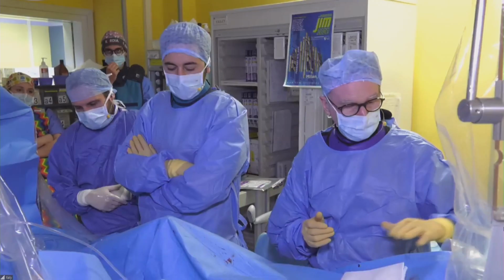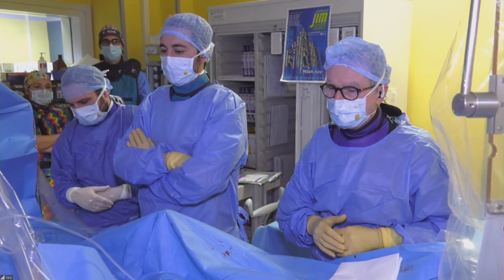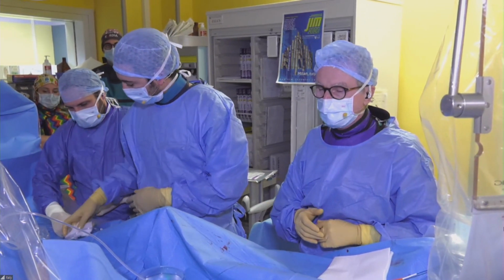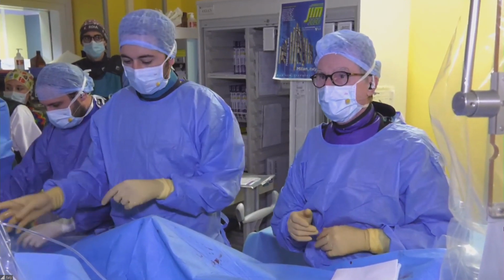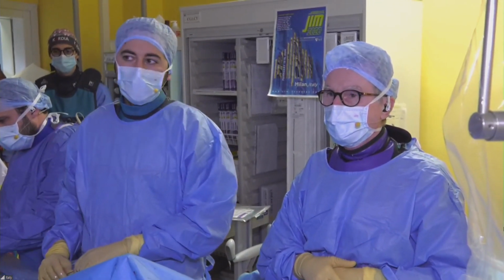So we have now a right radial approach, 7 French. We can use the 6, but we use 7 because we are using a Makoto IVUS, which is a little bit bigger. And we started with the LAD. We have a regular wire in the LAD.